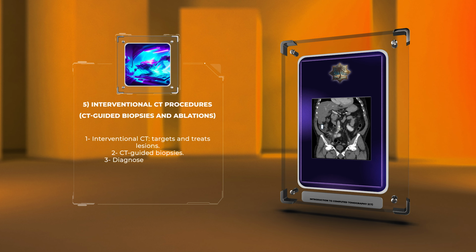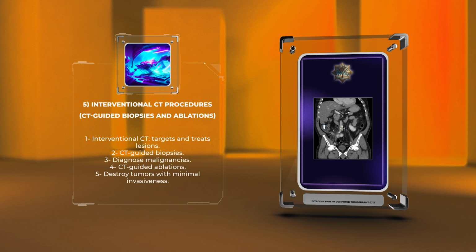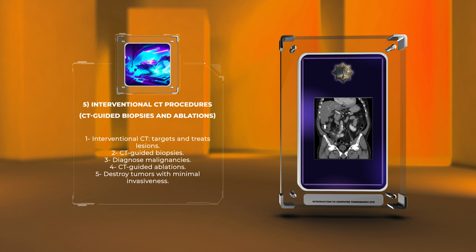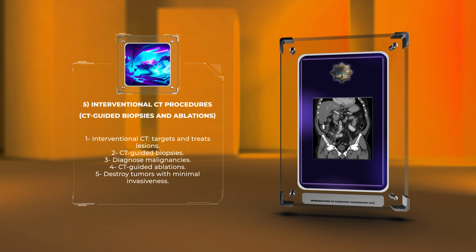Interventional CT is a precise technique that targets and treats lesions in the body. It involves CT-guided biopsies, which help diagnose malignancies, and CT-guided ablations, which destroy tumors with minimal invasiveness. These procedures are safe and can be done with local anesthesia or sedation.